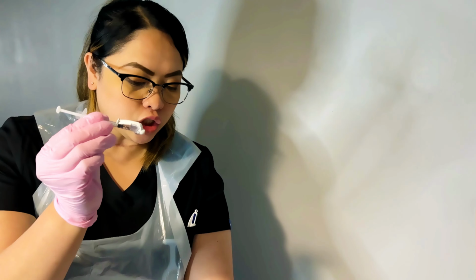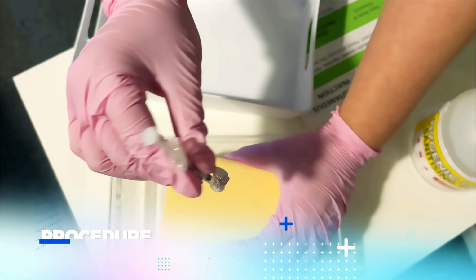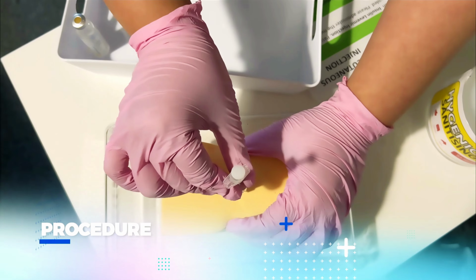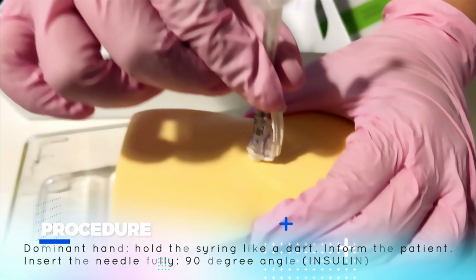Now, I'm going to take the insulin syringe. I'll hold it like a dart and make sure to inform the patient at the same time. I'm going to give it to you now. Sharp scratch. Holding it like a dart. 90-degree angle. Okay, sharp scratch.